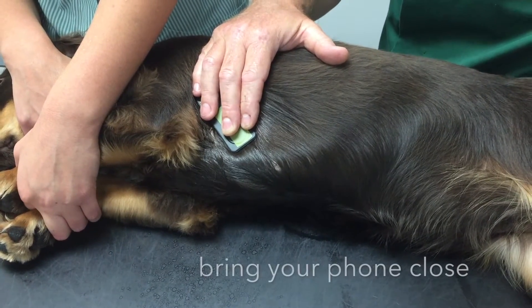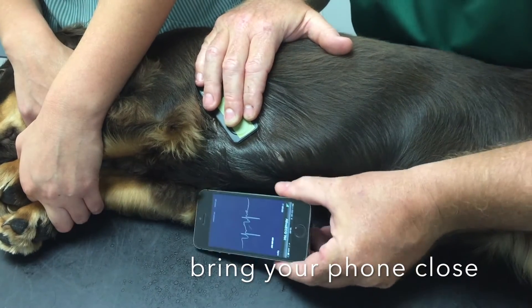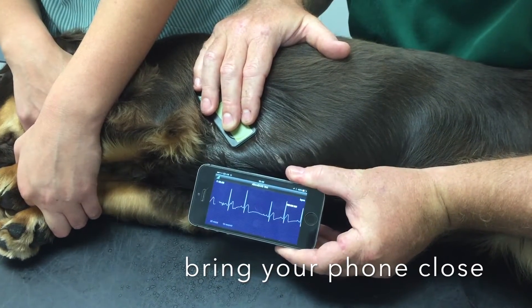Hold your mobile phone within 10cm of the device, and the ECG will automatically start to record.